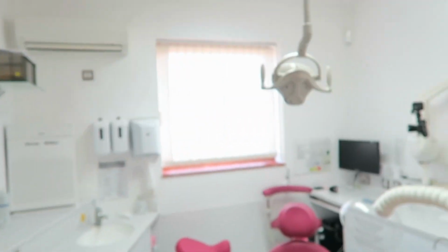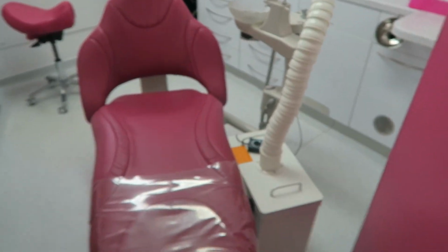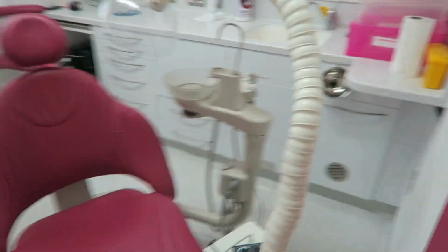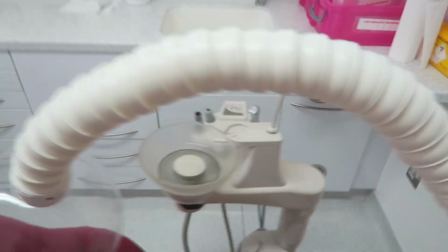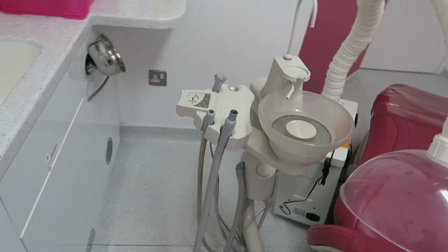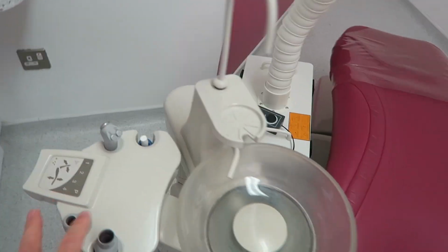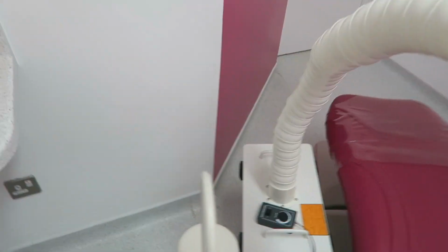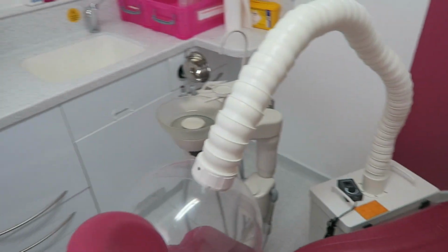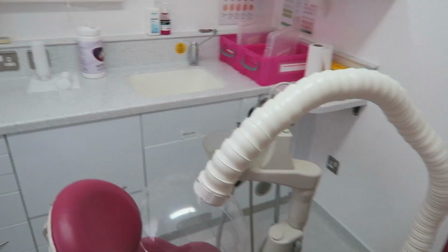You'd imagine that with the VacStation, because it's about the same size as the DentalAir, I've popped it down here, that there wouldn't really be a problem. But if you remember, I had to actually move this out, and the issue then comes with the fact that this now closes off the walkway in this surgery, or makes it rather awkward, and there's not much of a gap through here. So there is a little bit of an issue there in terms of pulling that forward.